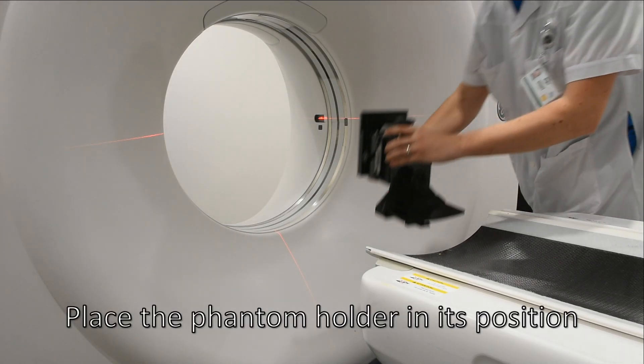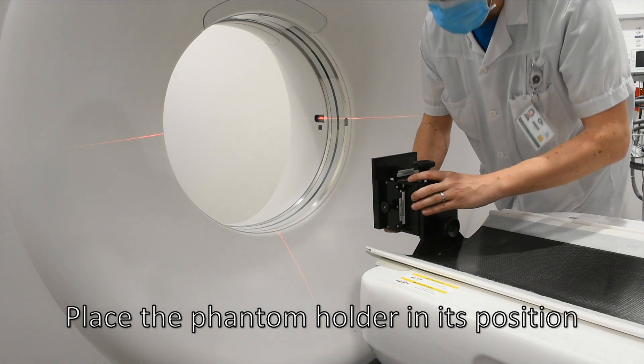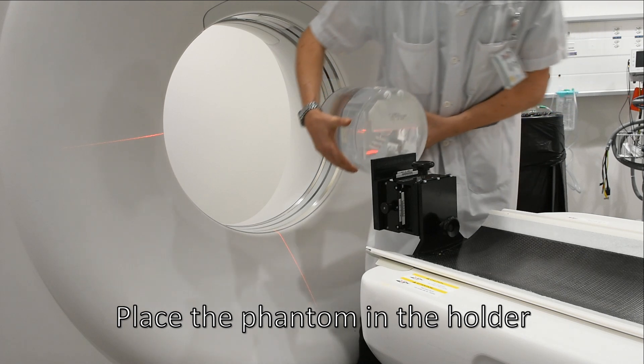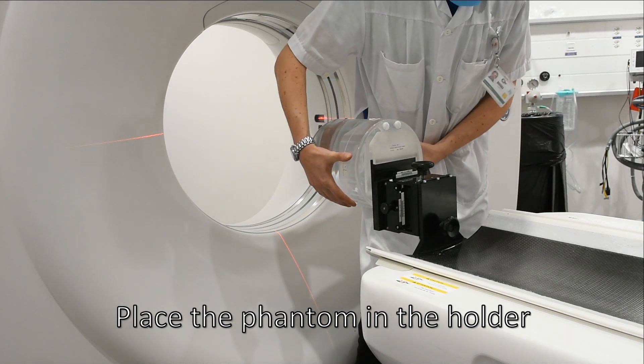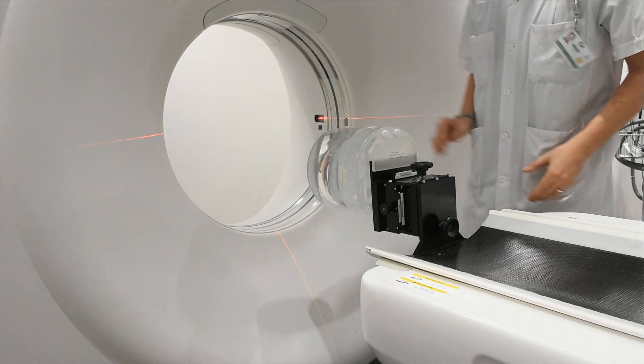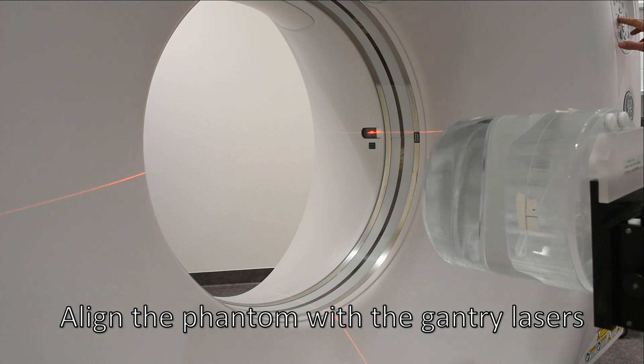Place the phantom holder in its position. Place the phantom in the holder. Align the phantom with the gantry lasers.